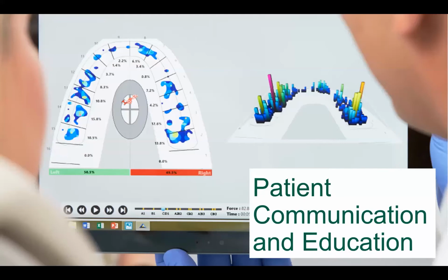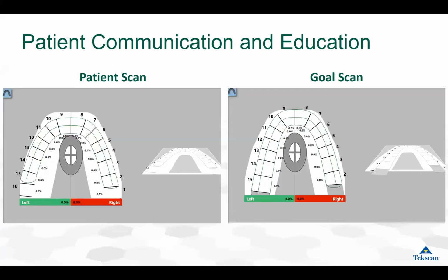So let's look at a case that showcases how T-Scan Novus Core can be used effectively to help educate and communicate to your patients. We work with doctors across the world, and you notice signs of occlusal disease in their patients. The obvious next step for the dentist is to get some records and try to find out what that underlying issue is and come up with a treatment plan to help the patient.